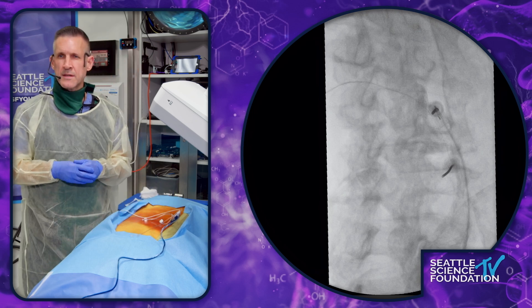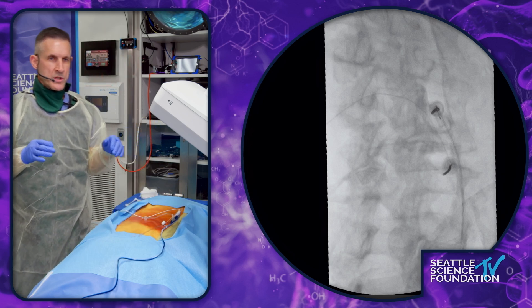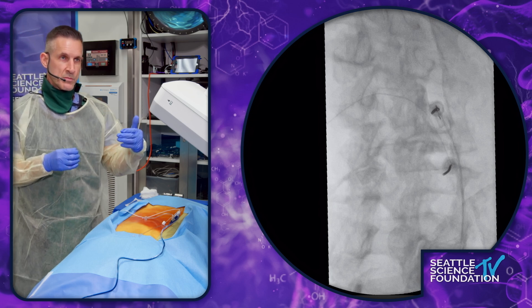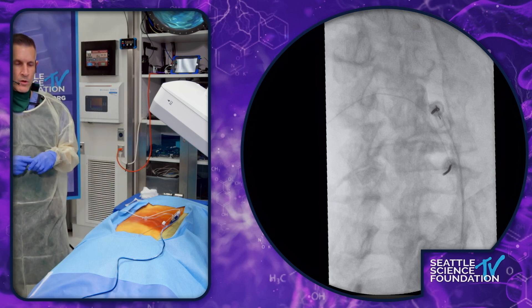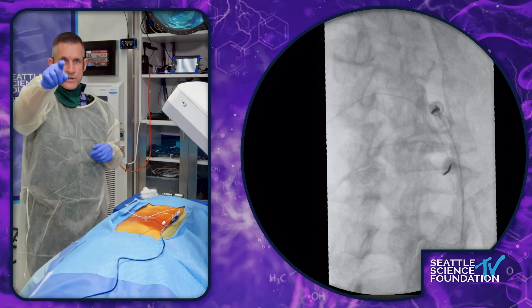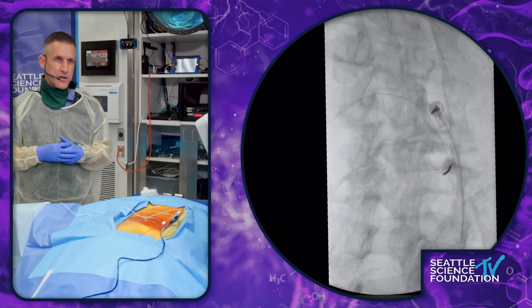We get this where we want it and then we open up the tines. You can kind of see the tines opening up there. What I always do is I want to see three different images to be sure of my depth and that I'm in a safe place. Everything we're doing today, we're showing you how to do things reproducibly, safely, and efficaciously. I always start in this oblique image and go to a lateral image. The goal in the lateral image is to obviously make sure you're remote from the foramen, but also to make sure you're close to the facet, because we know the medial branch leaves right about where the Scotty dog's eye is and walks its way up into that facet. So if I lesion at this place — that confluence between the superior articular process and the transverse process — I should have an effective treatment.